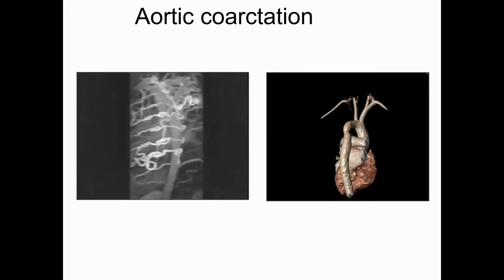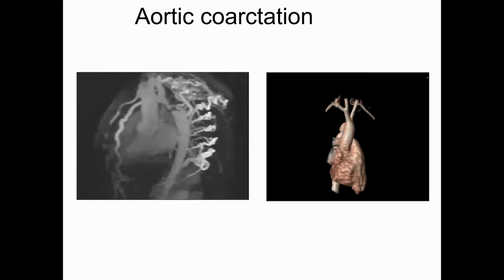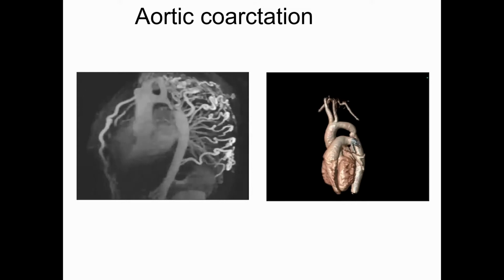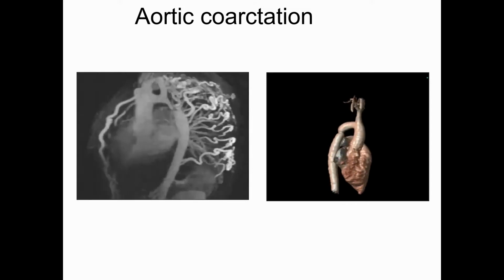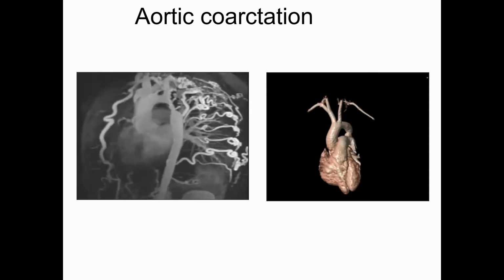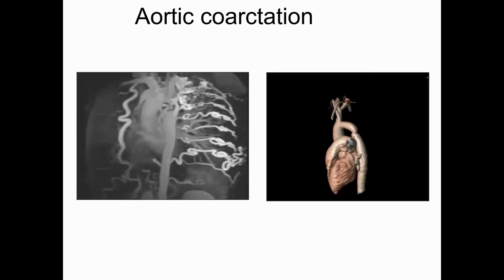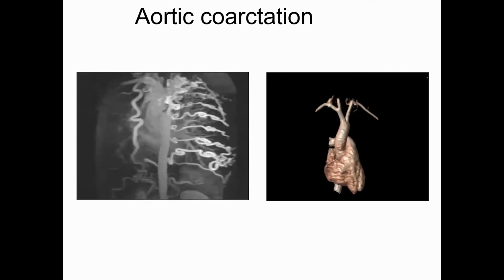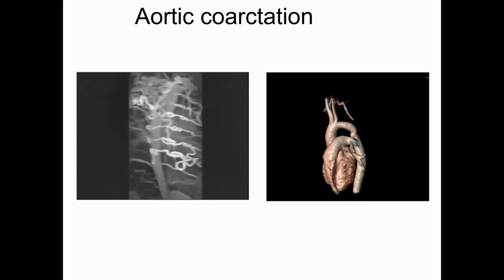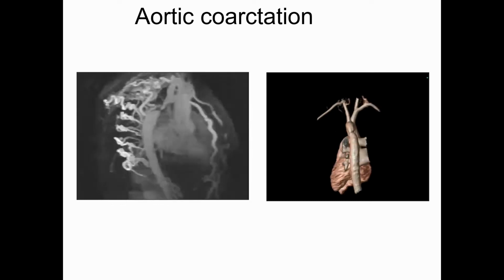And we use it a lot in simple congenital heart disease. I would say simple because coarctation isn't one of the most complex congenital heart diseases that we talk about. Coarctation patients have often been repaired young. They still need lifelong surveillance, even if they were repaired as a child. You don't necessarily want to be doing a CT scan every year or every two years. Even if they've got stents, we can still image them. Cine images don't work very well, but black blood images can give us an idea of what's going on inside the stent. So lots and lots of MR is done for repaired aortic coarctation. But again, CT will give you comparable information.